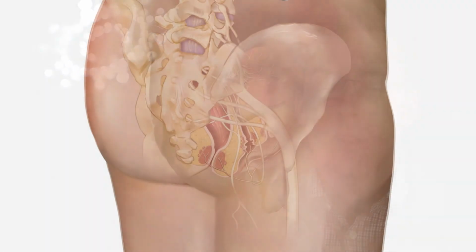Now, this lead can be removed at a later date. However, again, it doesn't simply pull out like our temporary lead in the peripheral nerve evaluation. In some individuals, especially larger individuals, that temporary lead might get pulled out too easily, or in different situations like non-obstructive urinary retention, it sometimes takes longer to get the right results. So in that situation, we like to put in the more permanent lead that's not going to move around.